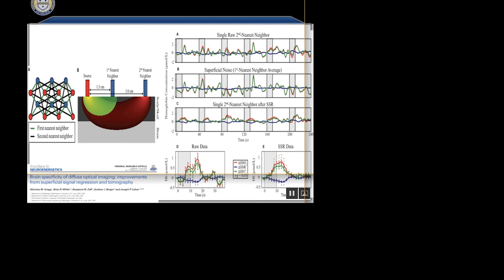And then that's the other half of the question. I think Rob's group is more in favor of just having a couple around the head. Rickson Mosquito, who's out of Brazil, he came from the UPenn group, is adamant that you actually need a short distance for every source and a short distance for every detector. That for every one measurement that you care about, you actually need two short distances, one on both sides. So I think that's a little overkill.